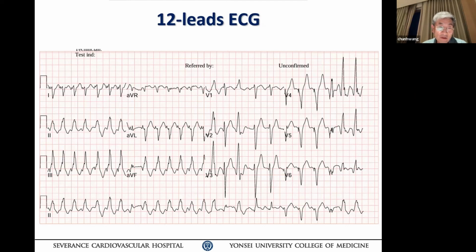So you need to question why you don't see a clear-cut P wave. In lead 1, what is that small blipping in front of the QRS? Very sharp blipping. Is that what you think is a complex, V or A? Lead 1, you can see a very nice sharp potential. And the patient's heart rate is what? Fast and irregular. QRS duration fluctuates according to the rate.